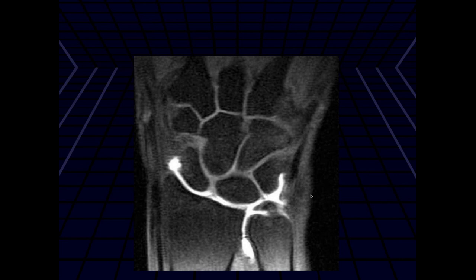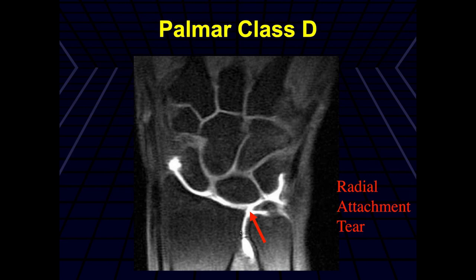This is a wrist arthrogram, and we can see there's what appears to be a central tear of the proximal TFC disc, with contrast signal intensity extending into the DRUJ. This is actually a radial side tear rather than a central tear — it's at the radial insertion to the articular cartilage. So this would be a Palmer class D type tear.